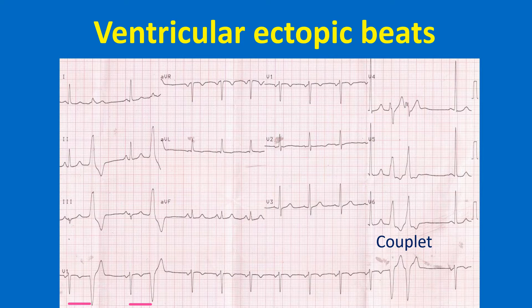All the VPCs have the same morphology, indicating the same focus of origin. Unifocal VPCs usually have the same coupling interval. The couplet occurs at a cycle length of 400 ms. If this progresses to a ventricular tachycardia, the expected rate will be 150 per minute. The two beats in the couplet do not have identical morphology in all leads — have a look at leads V4 to V6. This may indicate either different foci of origin or different conduction paths in the ventricle.